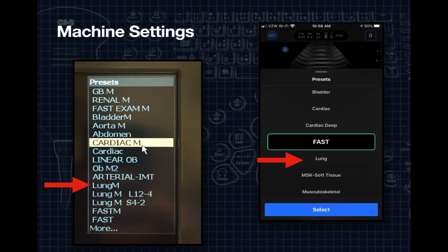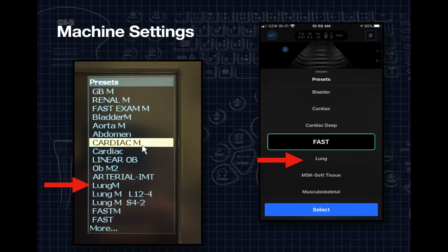It's important to pick these presets because they optimize the machine settings for best lung visualization. Ultrasound machines generally have compound imaging and harmonic filters that smooth out the image, which is helpful for exams like gallbladder or kidney where you rely on anatomical structure. But with lung ultrasound, we're relying on movement and artifacts — so we want these filters turned off. When you pick the lung preset, it will, by default, have these filters turned off.